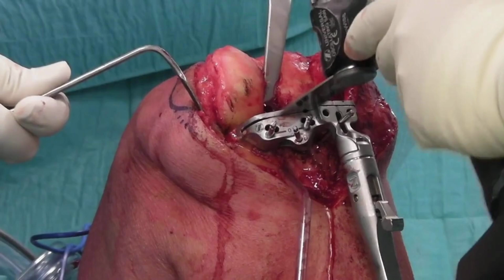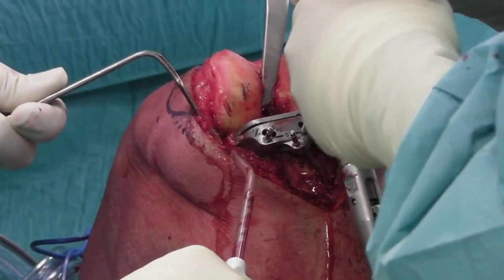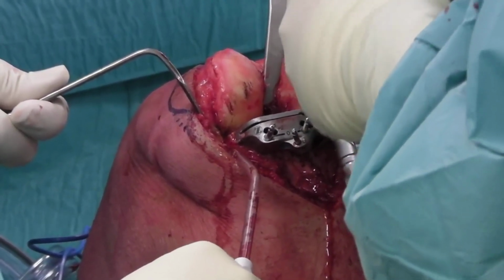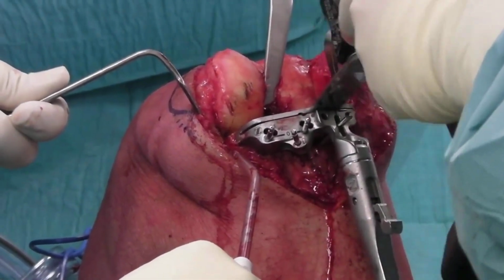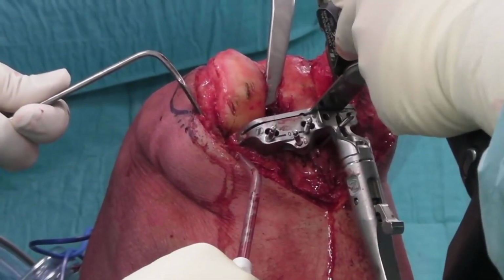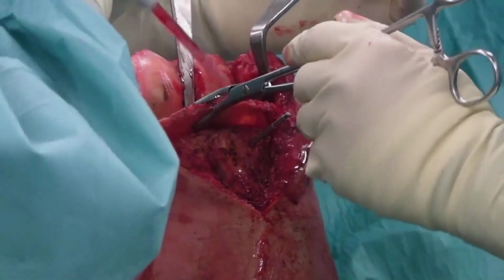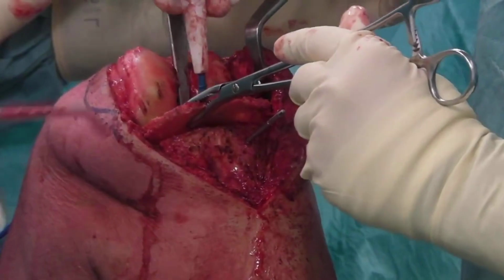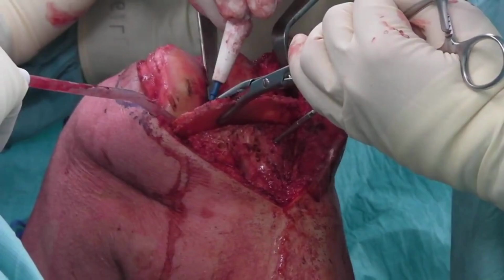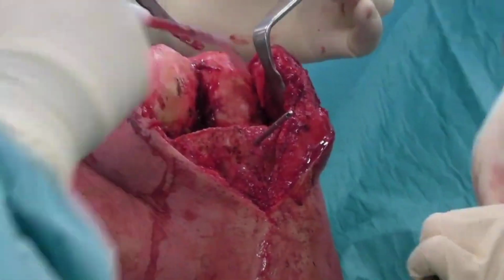In the case of the tibia, the cutting guide is stabilized in the desired position with 3 temporary metal pins, which prevent the guide from moving while we use a saw to cut the bone. After completing the cut, we remove any soft tissue that is still attached to the bone. As you can see, the bone cut is now limited to a few millimeters in thickness.